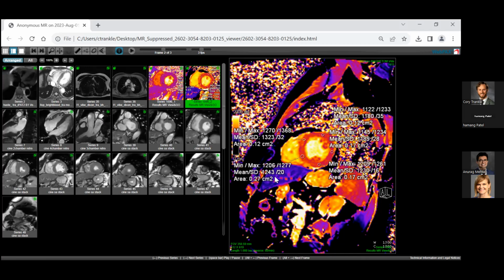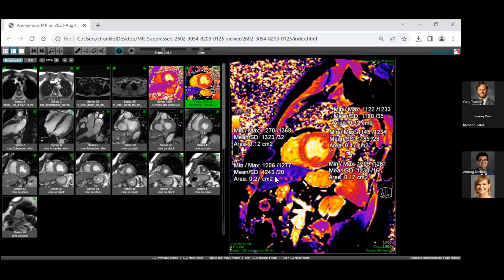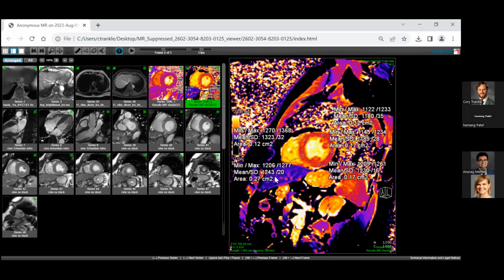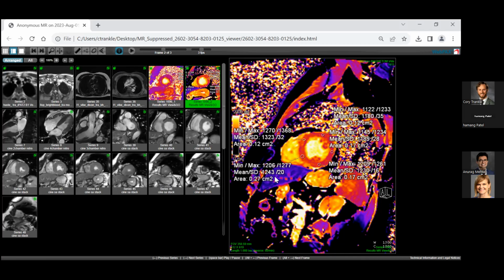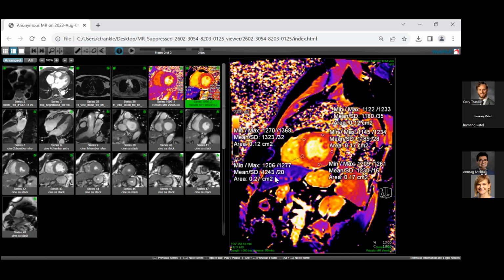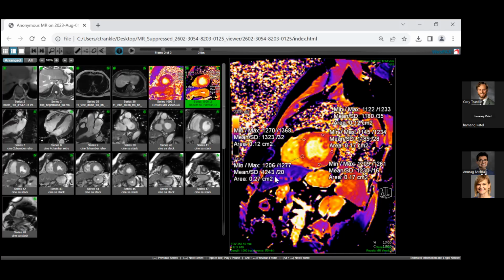So as we age, this T1 value is going to be higher. If we were to do teenagers, provided they don't have any other disease process, because of the ratio of myocytes and stuff in the extracellular space, T1 is going to be at 3 Tesla about 1,050 milliseconds.